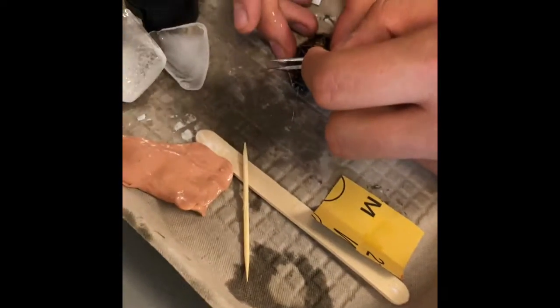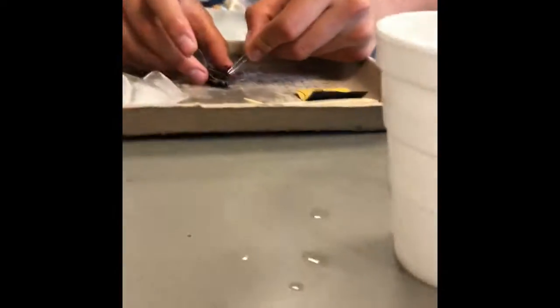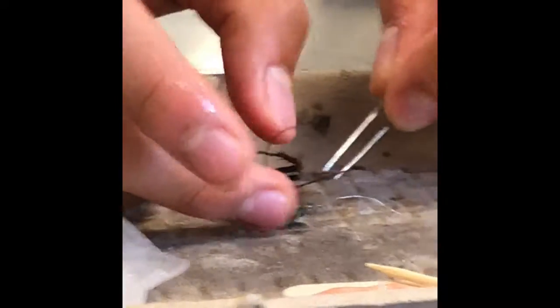Anesthetize the roach again and repeat the previous step exactly, but this time with the right antenna. When finished, fold back the wire slack on top of the connector to not get in the way of the roach walking. Apply a hot glue on the connector and smudge it down with flour so the glue doesn't stick, and put the roach back in its terrarium with food and water and leave it there overnight.